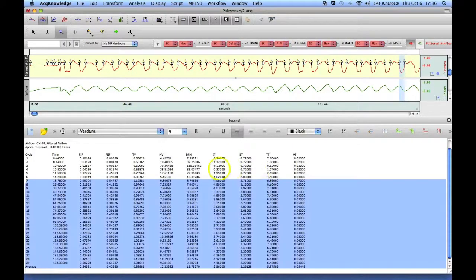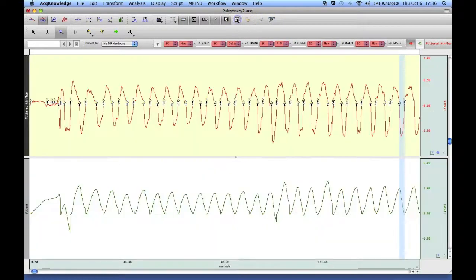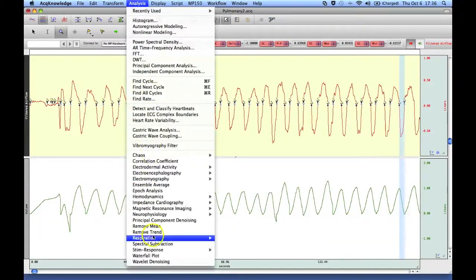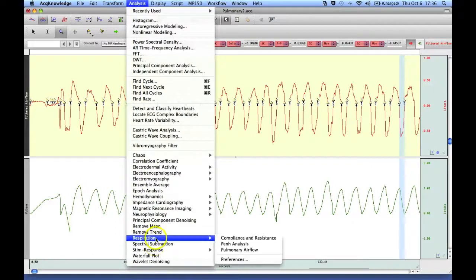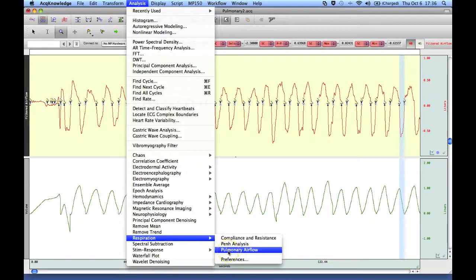And that concludes this demonstration of the acknowledge respiration pulmonary airflow analysis routine. Thank you.